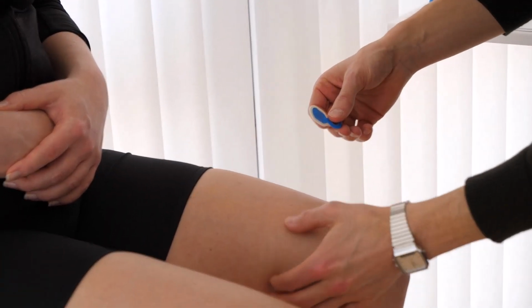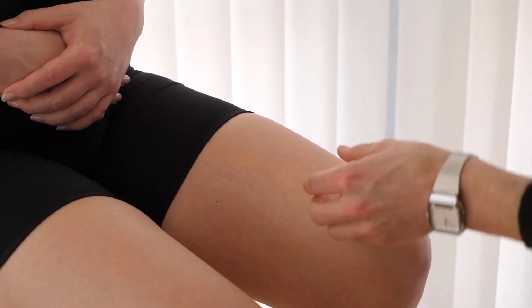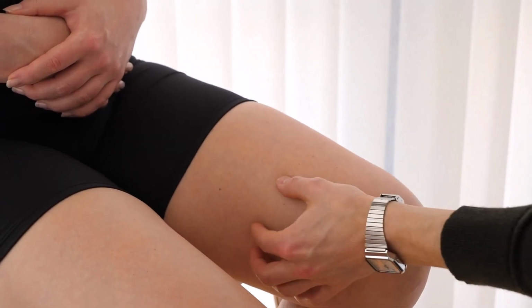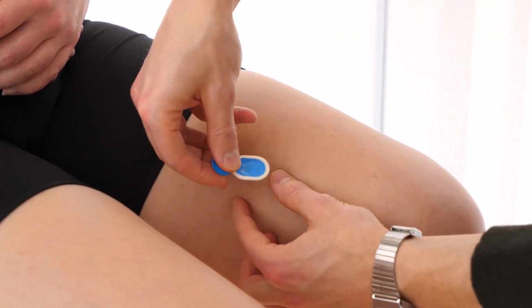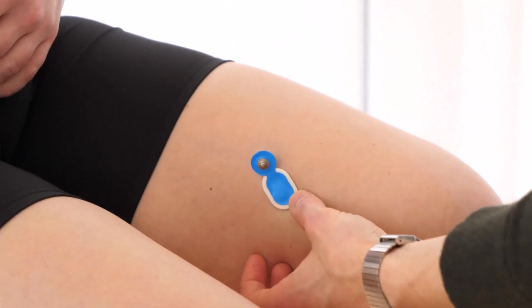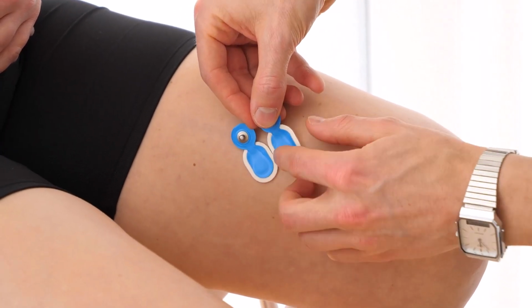It is important to pay attention to the course of the muscle fiber when applying. The vastus moves approximately in vertical direction, which is why I attach the electrodes in this position. It is also important here that the electrodes are pressed on the outside first. Also, the electrodes should be positioned directly next to each other.